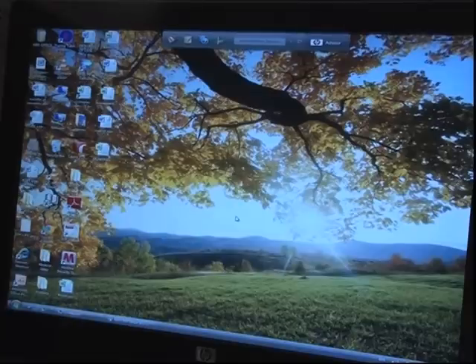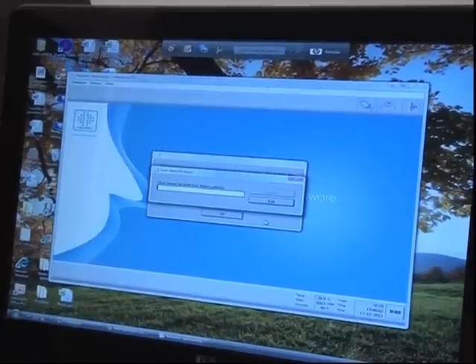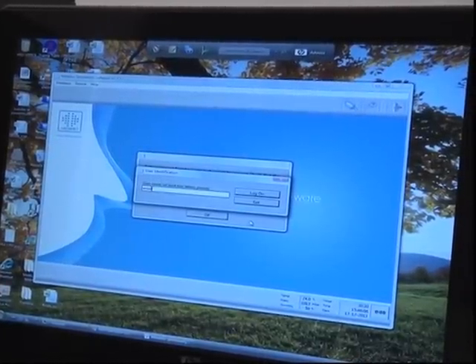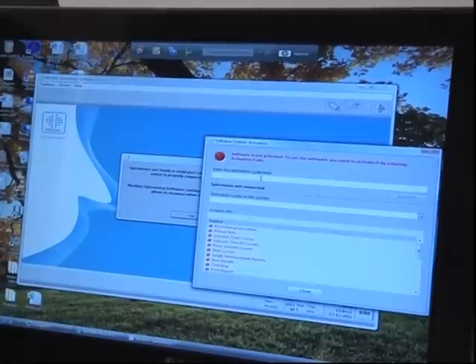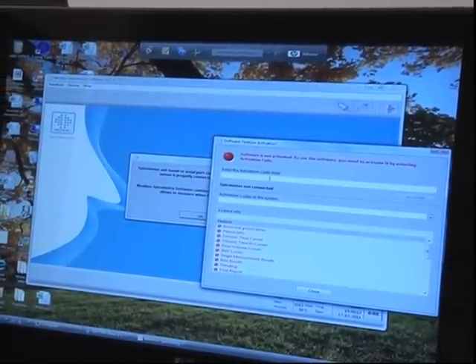Now we come to the installation of the device. After clicking finish, it asks for the username. Entering the name, we log on. Then it asks for the activation code, which should be entered after the installation of the device. Hence, we learn the installation of the device.